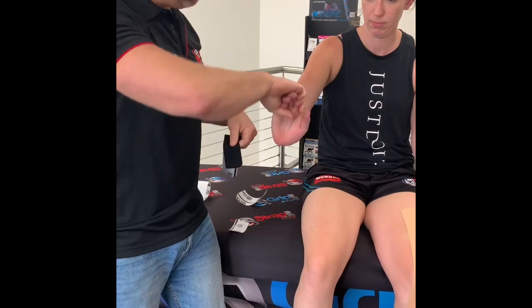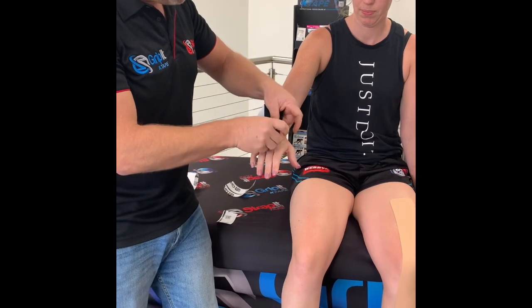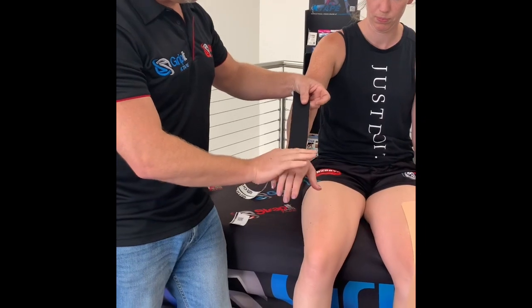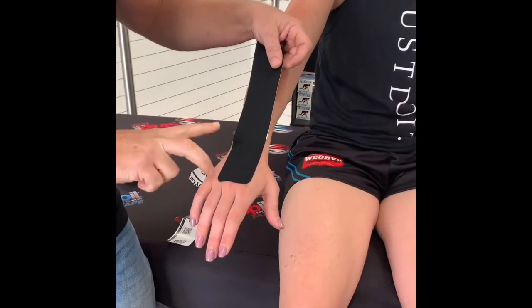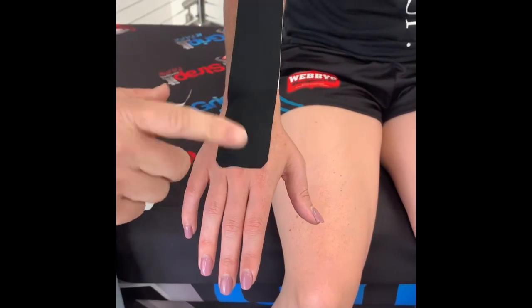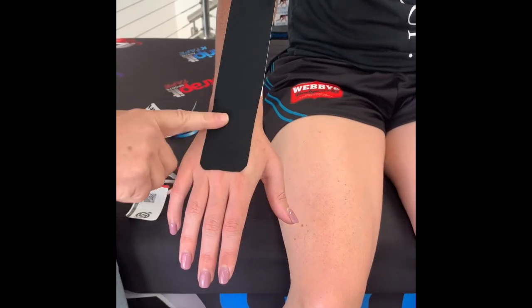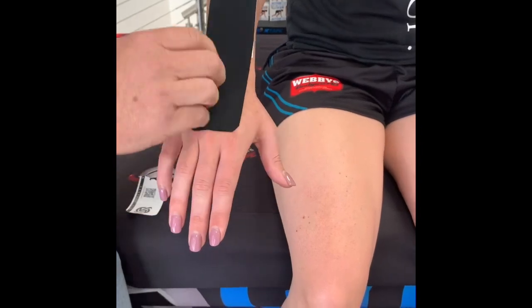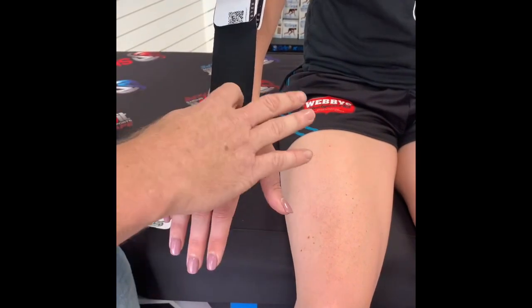Okay, so we're looking here at wrist range of motion, okay, and we're looking at the wrist extensors. So again, as per the principles of active tape application, we make sure that the joint will be in the shortened position. Now, if you come in close here, please, you can see, again, this is a very good sized anchor, okay? It doesn't have to be of the greater length of the lower limb, but as much purchase area as you can get on this part of the body. So that's the anchor, and that's about 2 inches. It's a lesser width tape as well, so we don't need to go too long, but we still need a good at least 2 inch anchor.